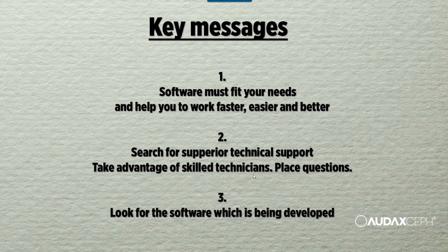The second, very important thing is technical support. Is it available or not? Will these guys on the other side of the globe be available to help me when I need them, when I need technical support or not?